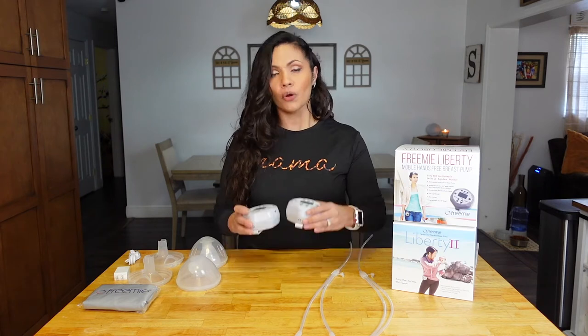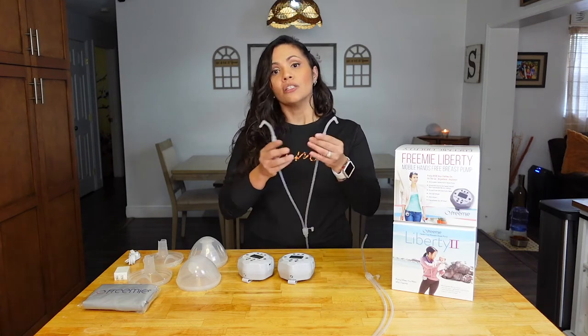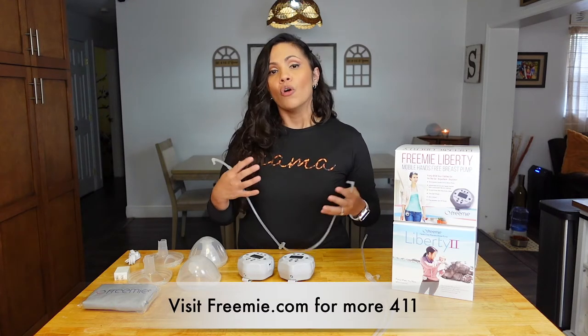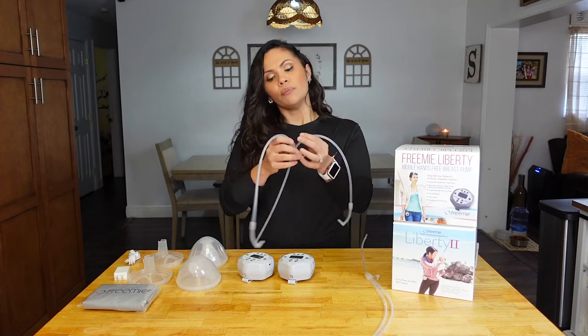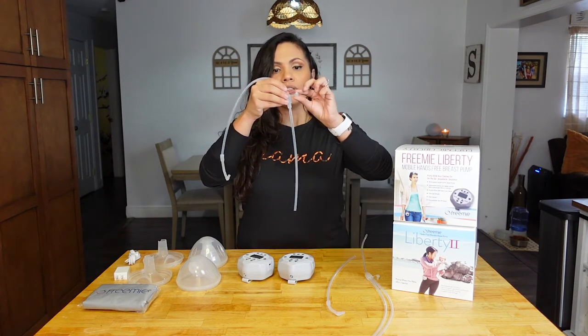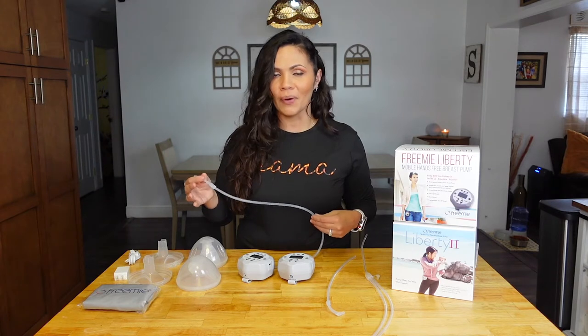Some more similarities: they're both hospital-strength pumps and they are both single or double electric breast pumps. So whether you need to attach both cups because you're pumping both breasts, or you only need one — maybe your little one just latched and one side still has a little bit left — you can easily adjust it. Simply remove one of the tubes, close the hole from the side you won't be using, attach the cup, insert, and start pumping. Really simple.